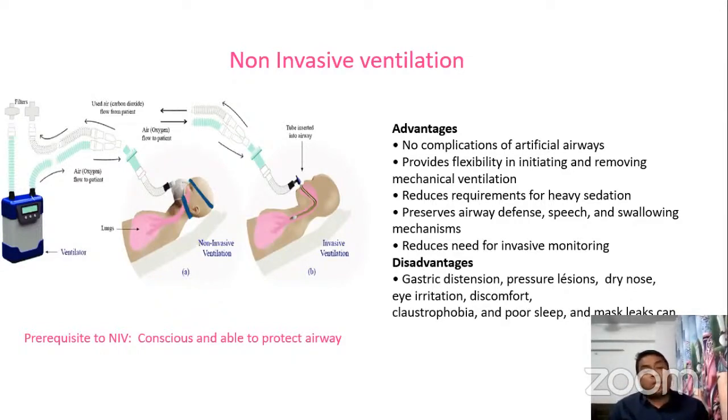There we can avoid the complications of an artificial airway. It gives flexibility to the patient. He can sometimes remove the mask, can talk and eat. There is no need for heavy sedation in non-invasive ventilation. It preserves airway defenses, speech, and the swallowing mechanism.